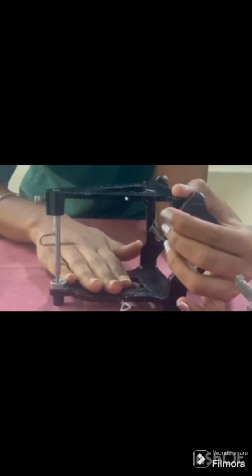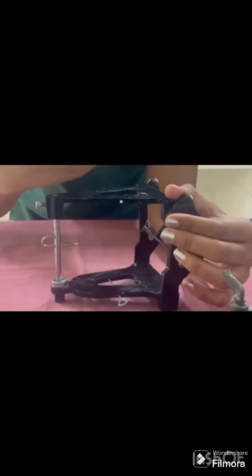What are the requirements? There are minimal requirements and additional requirements for an articulator. Coming to the minimal requirements: it should hold the cast in correct horizontal and vertical relationship. It should provide a positive anterior vertical stop, the incisal pin. It should open and close in a hinge joint. It should allow protrusive and lateral jaw movements. The moving part should move freely and the fixed non-moving part should be rigid.